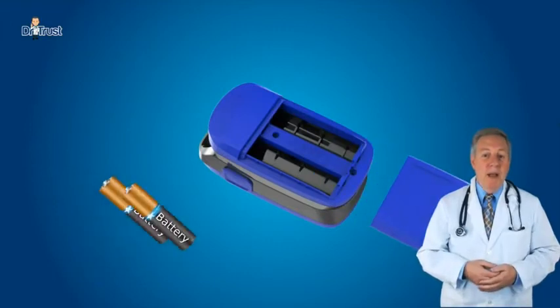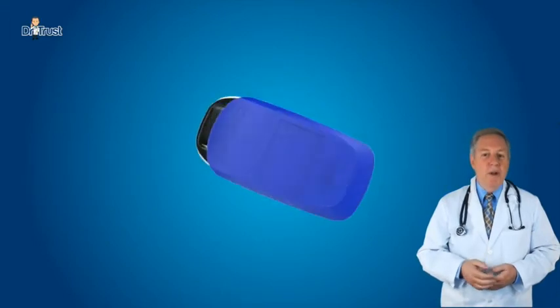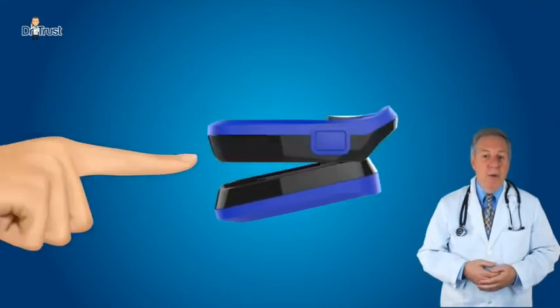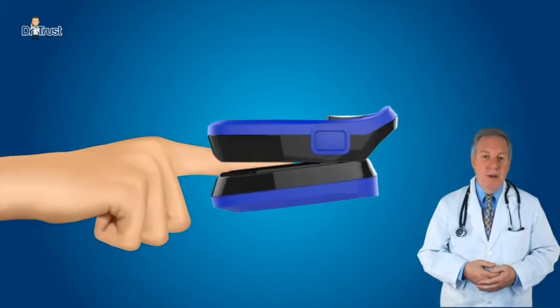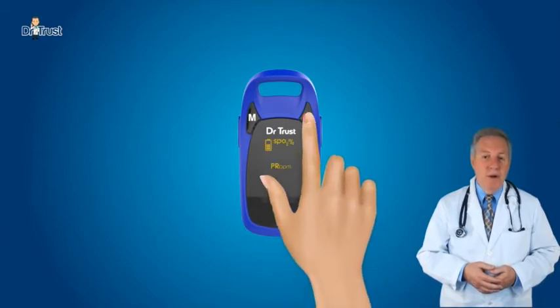Insert two AAA batteries in the correct polarity and put the cover on. Put one of the fingertips into the rubber hole of the oximeter with the nail surface upwards and release the clamp. Press the power button for 2 seconds to turn the pulse oximeter on.